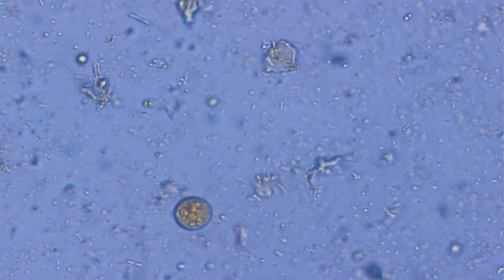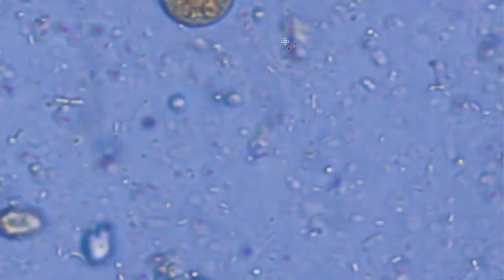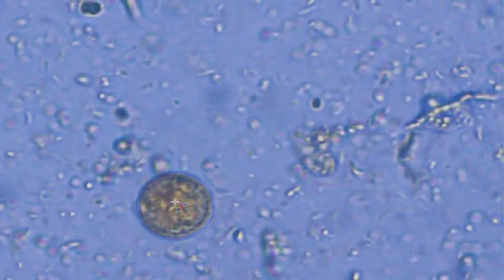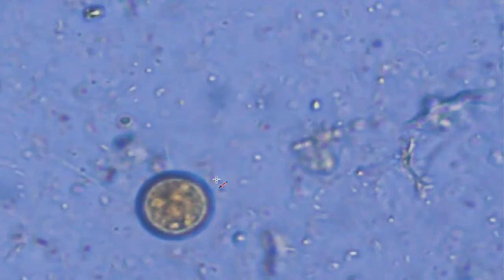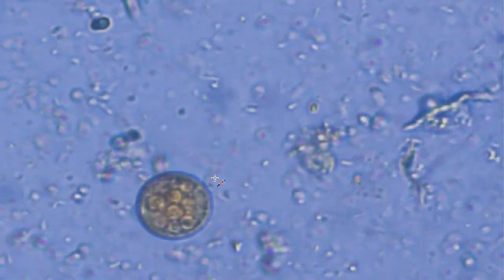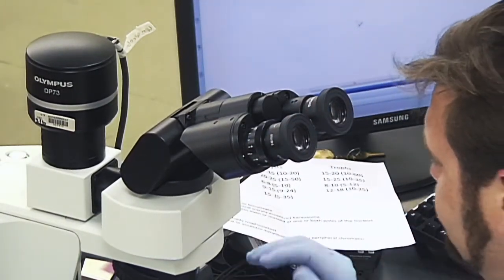Let me delete that and zoom in for you. You possibly may not be able to see very well, but let's see if we can find the actual nuclear morphology a little bit. Very difficult to see the nuclei. And as I've got closer, I see there's actually more than 4 nuclei. So this is an Entamoeba coli. It's just a very small one, and that can happen. So this is all Entamoeba coli. Let's move on to Entamoeba histolytica in wet preps.